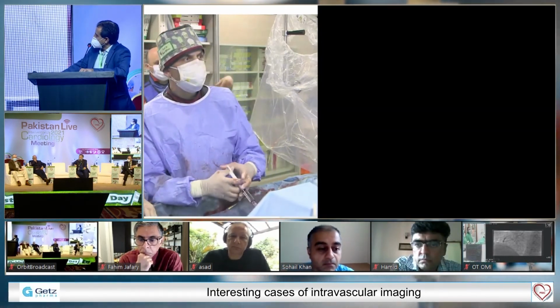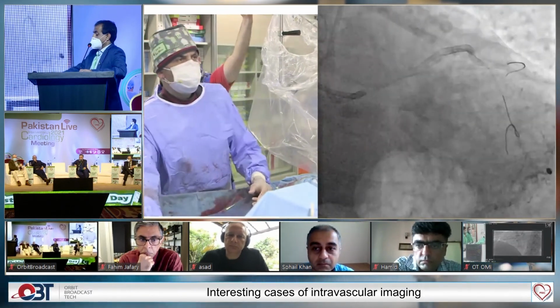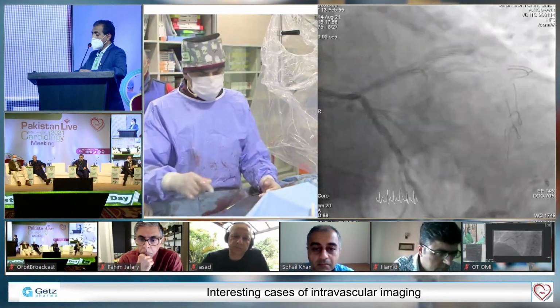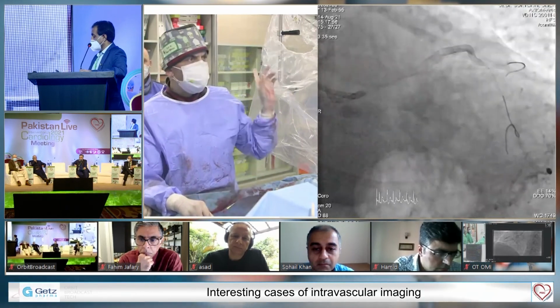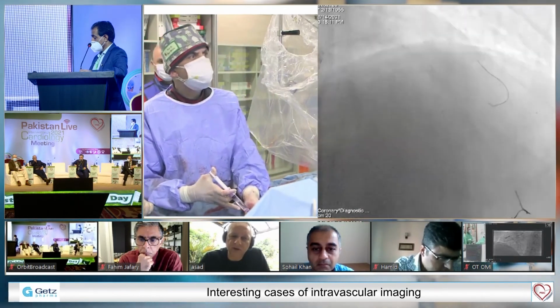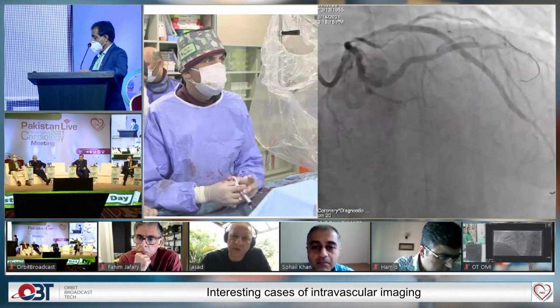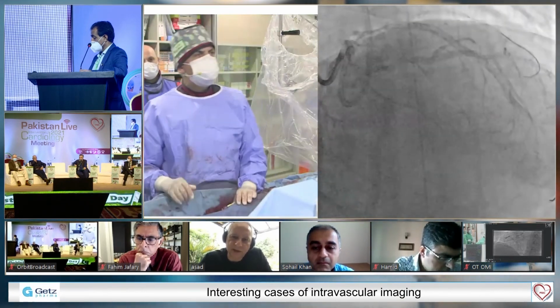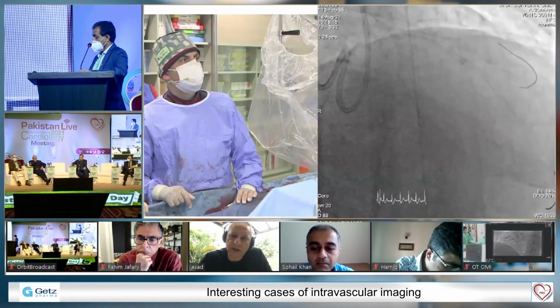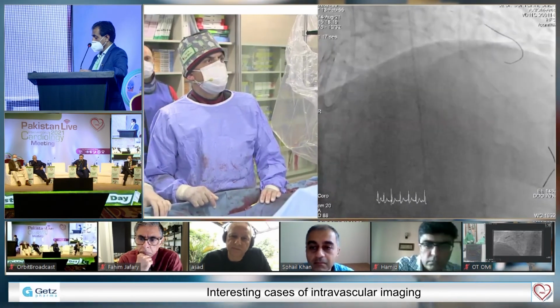Umar, we have 10 minutes left, so I guess we will be just finishing this case. So we will do more post-dilatation. Also, what do you think for the diagonal? Well, we saw on your IVUS that the diagonal ostium was not that diseased, so maybe just have a provisional approach. My question was more about the left main. Do you think you'll be able to spare the left main? Is there enough ostial or proximal landing area before the left main, or you'll have to stent up to the left main?